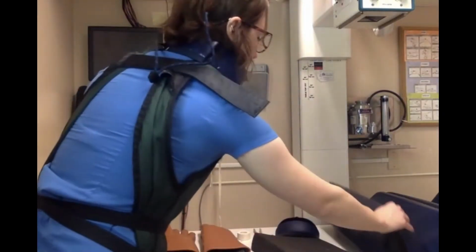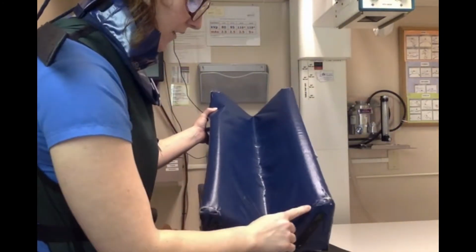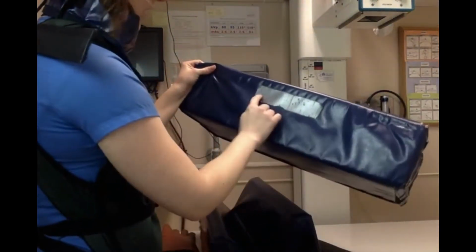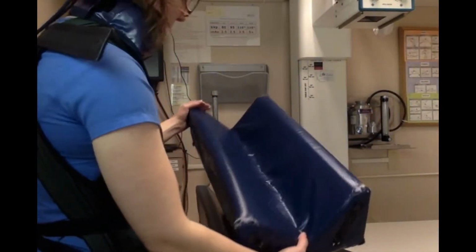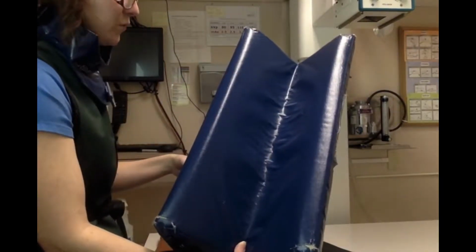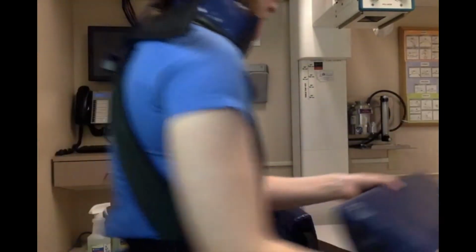We also have these foam troughs. As you can see, this one's a little bit older. It's got some cracks here, cracks along the line. It got cracked along here at some point and someone put some tape along there. All of those are going to be non-diagnostic. In an x-ray, those could show up, let the radiation through, and have different effects on our x-rays that we don't want in there.